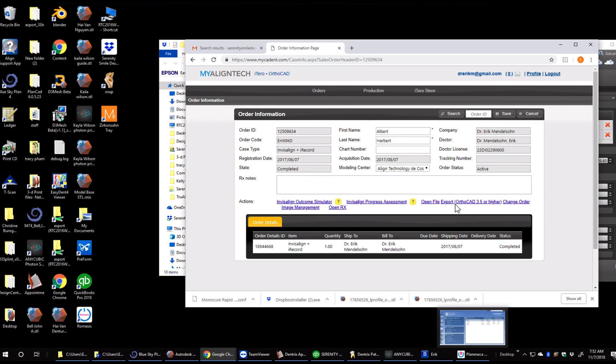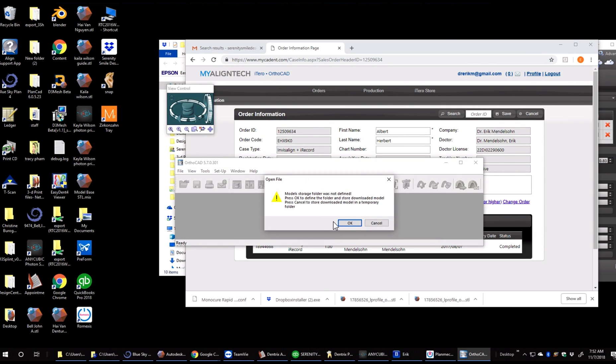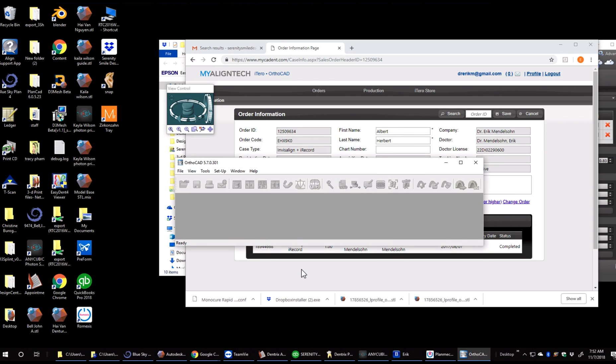Once patient's open, we're going to click export using OrthoCAD 3.5. And just wait it out. Click OK or yes to all the prompts that come up.